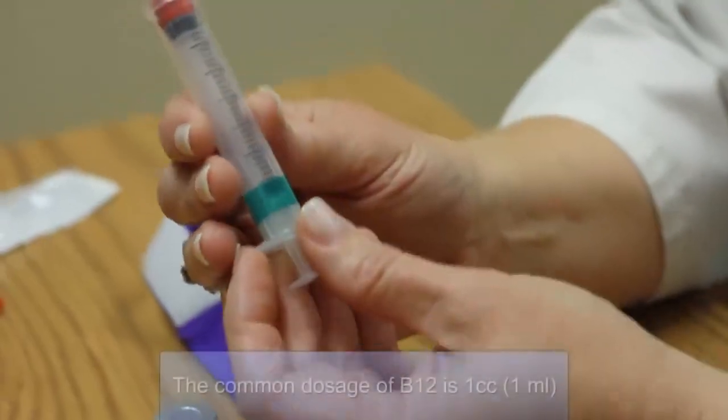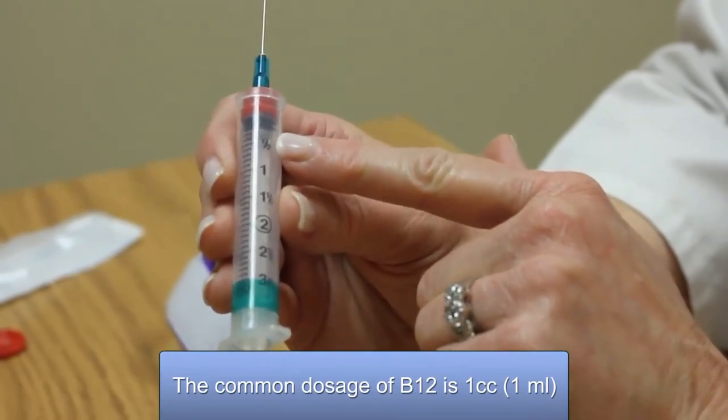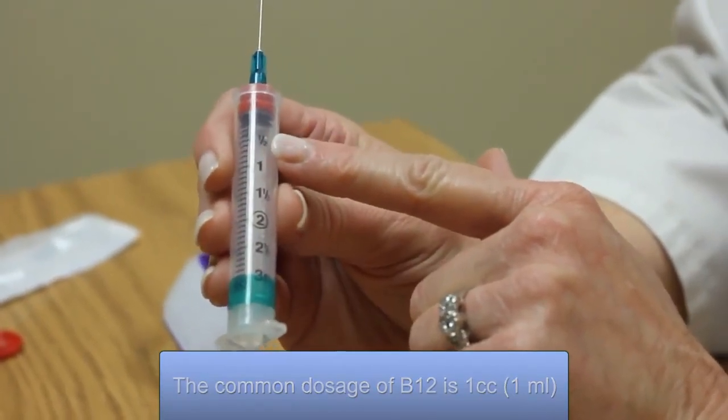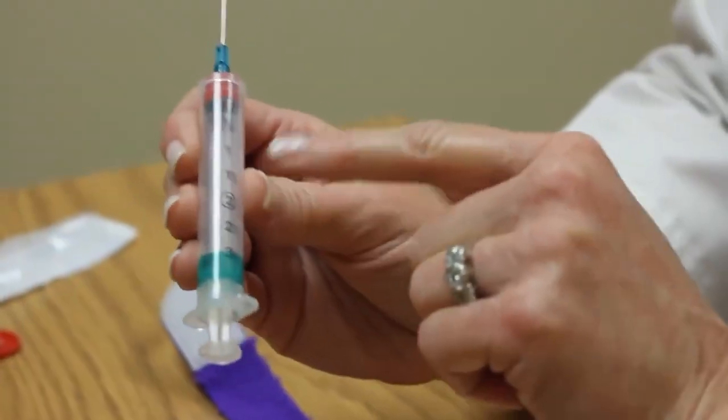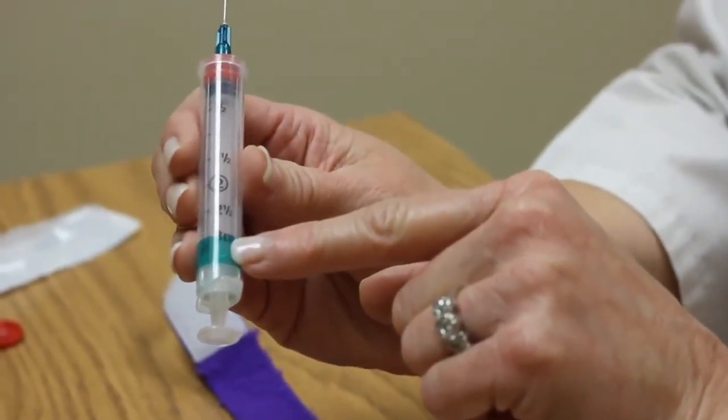Go ahead and open your alcohol swab and get it ready, or get your cotton ball ready. I'm going to take out the syringe. All of the syringes you use will always have numbers on it. The most common dosage of vitamin B12 is what we call 1 cc or 1 ml. According to your physician, he may choose to give you a different dose. On the 3 cc syringe, it's numbered from a half cc to 3 cc.